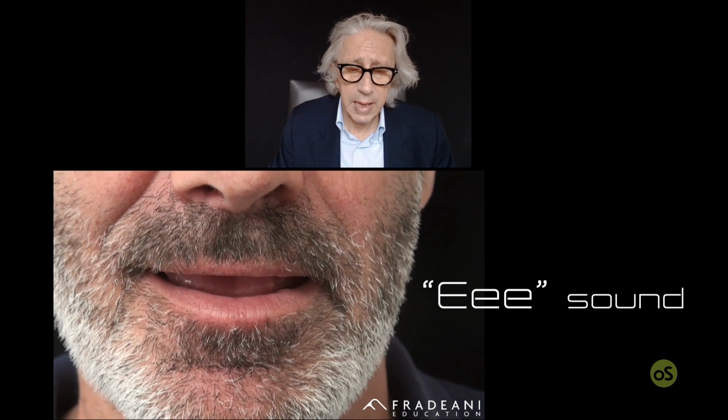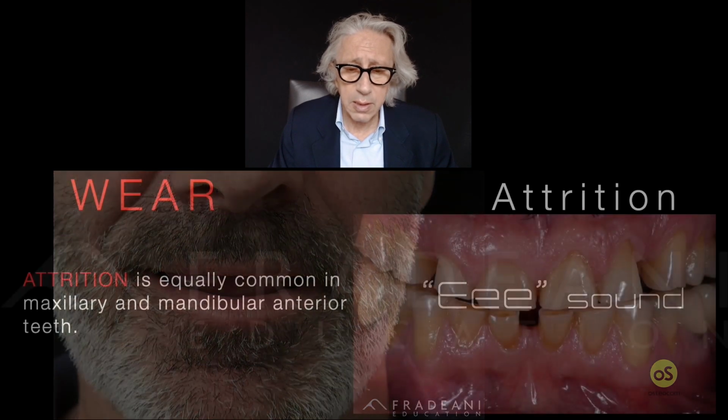When you say E, a prolonged E sound, you should see 50% of the incisal edge, 50% of the entire body of the lower and the upper. But you could see here, you cannot see any teeth at all. Again, that is the problem. So phonetically, all the tests say that you have to increase the volume of the teeth. Volume means not just the length, but also the body. The body was lost already, and enamel was lost there.